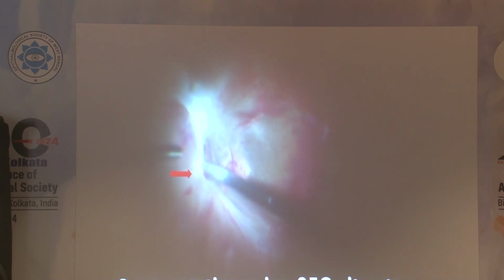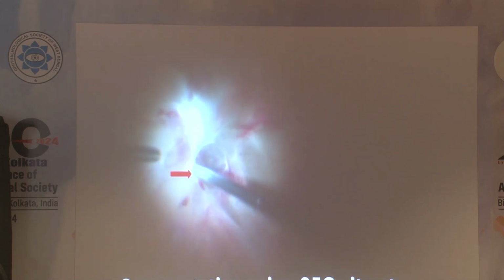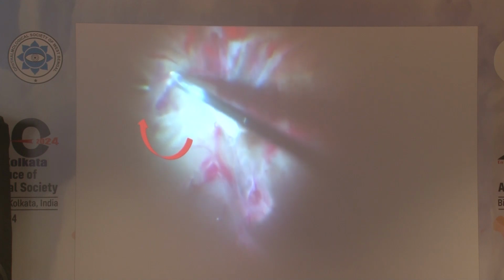Now we can see that we can use our vitrector to cut through and to segment this area to create different islands to release the traction. After cutting, the arrow points towards two flaps that are created. Now these two flaps will be utilized for peeling this vitreous off the retinal surface. We are creating an inferior island by using the vitrector and peeling this area off the retinal surface.